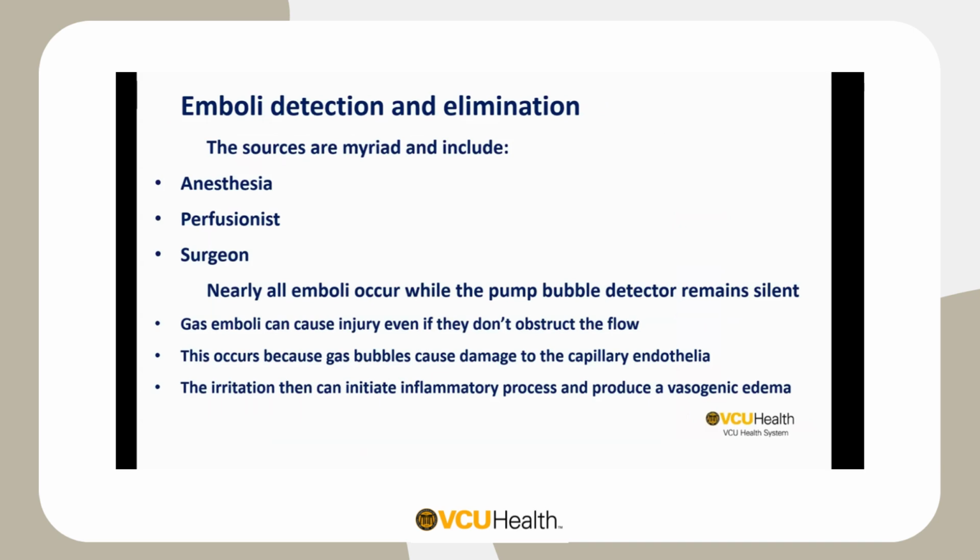It can recognize micro and macro emboli. Emboli at 40 microns adhere to the arterial line and tubing of the pump circuit. If those emboli are smaller, they can pass through the filter, go to cerebral circulation, and can be detected only with TCD.